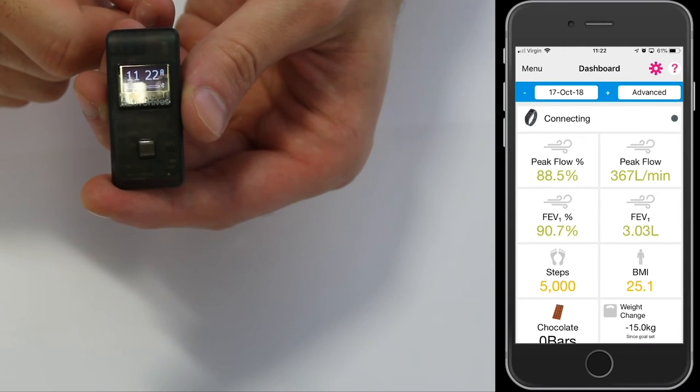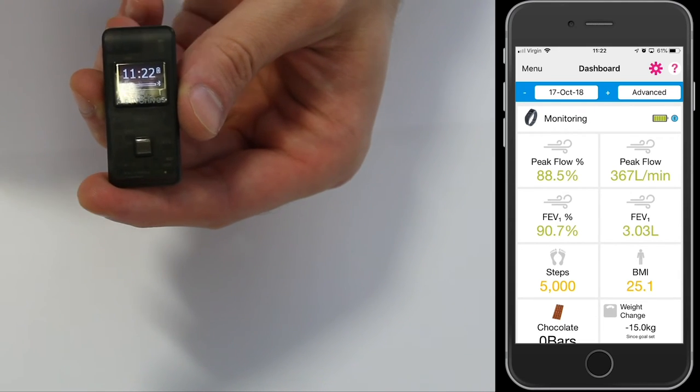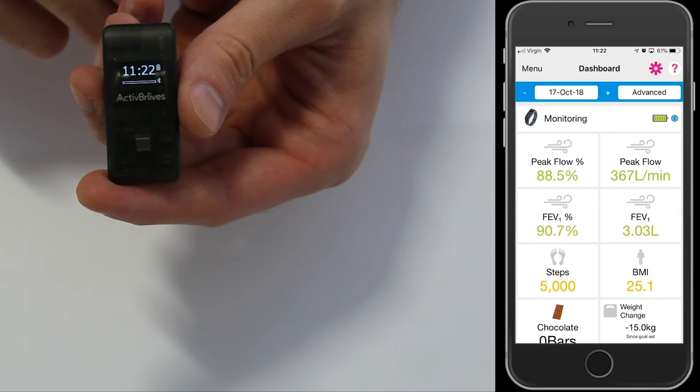Then you will see the Bodyband now has the clock screen, the battery, and a Bluetooth connected icon on the screen.